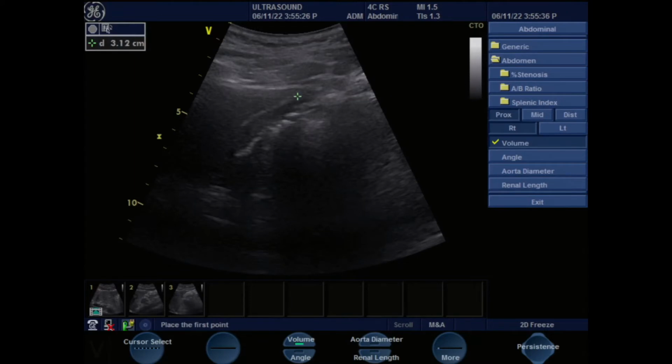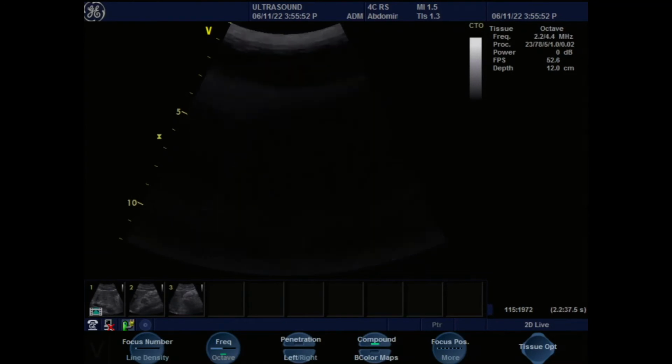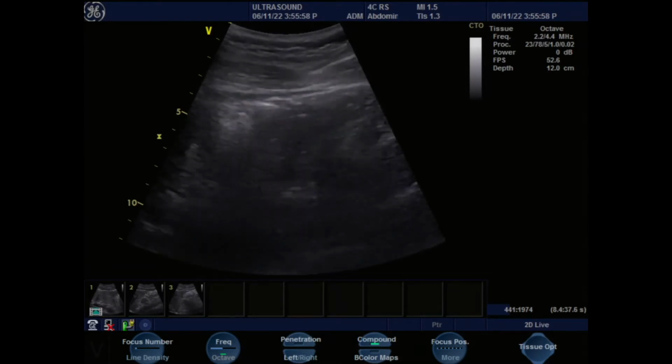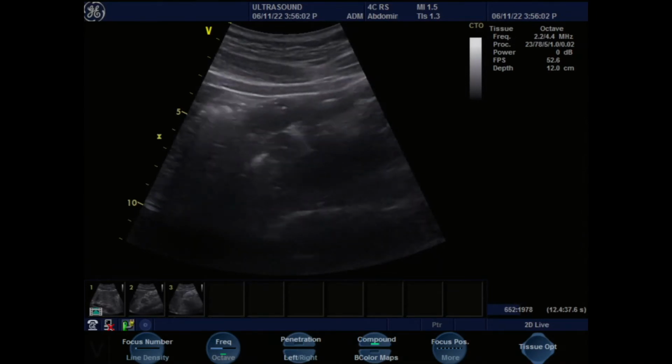So that's the gallbladder here. Basically, we can see it, head, body, and almost the neck of the gallbladder here. On him, I'm going to move more intercostal instead of the subcostal approach. Let me show you subcostal first, and then I'm going to go intercostal because I will be using the liver as a window to guide my sound. Since he's eaten and there's a lot of bowel there, I don't want to send my sound through all the gas and go to bowel much.